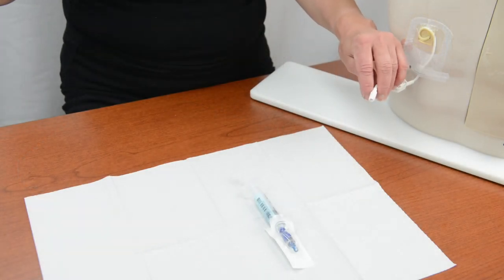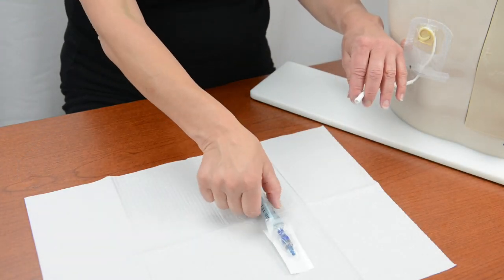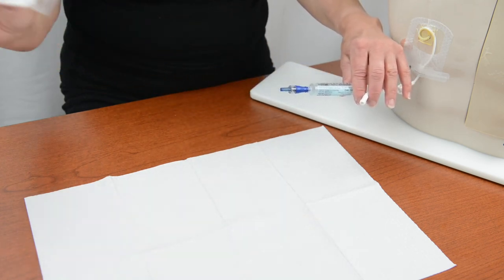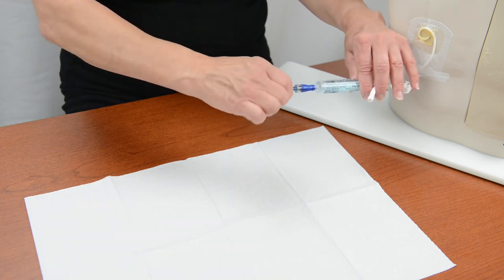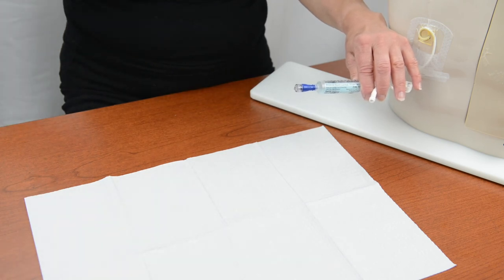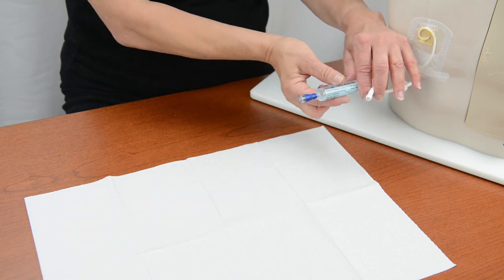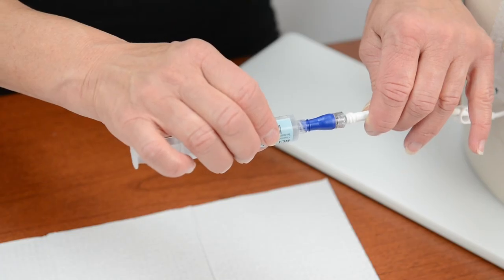Hold the open end of the catheter between your fingers without touching the sterile end. Remove the package covering the end of the needleless connector. Remove the cap from the end of the connector and put it into the trash. Be careful not to touch the open end of the catheter or the sterile end of the connector. If you accidentally touch the sterile end of the connector, throw it away and start over with a new one.